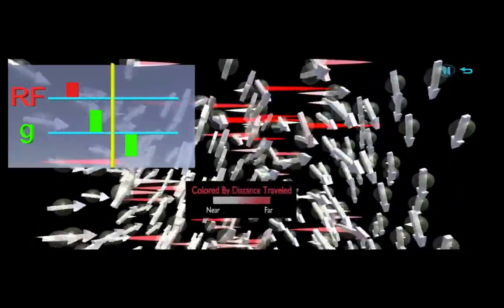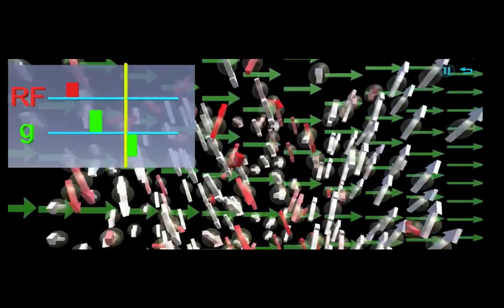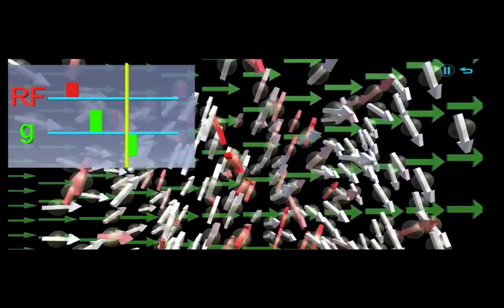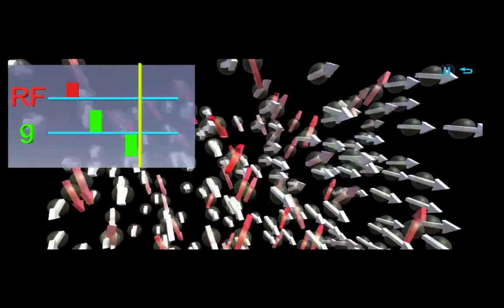But what usually happens is after we apply our dephasing gradient, there's some diffusion where these hydrogen protons are going to be randomly walking around according to the principles of Brownian motion. So now, after we do our rephasing gradient, it didn't cancel everything out and bring everything back to the state it was in the beginning. Because there's been diffusion, now if we took a signal from here, if there's a lot of diffusion, there's going to be some signal loss.